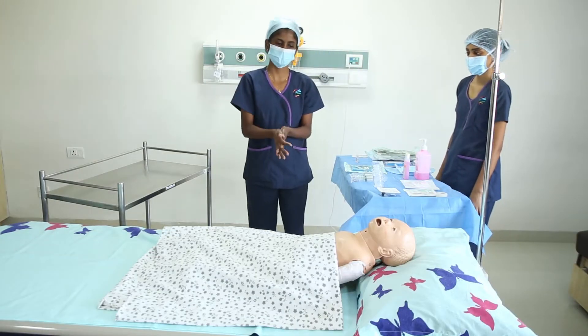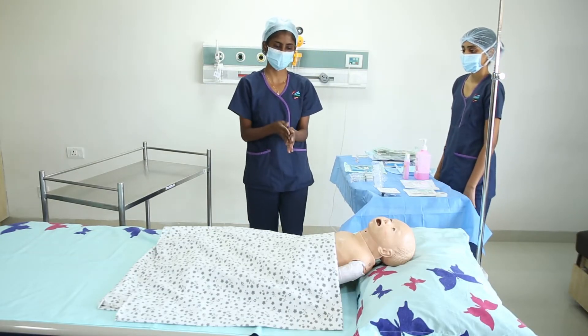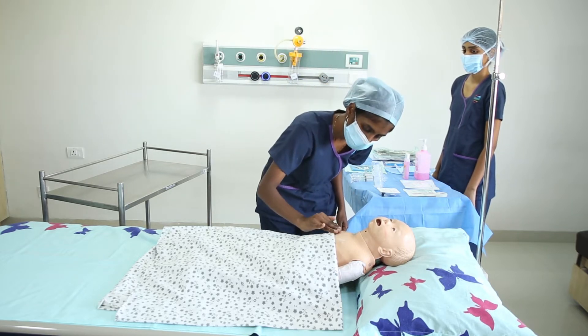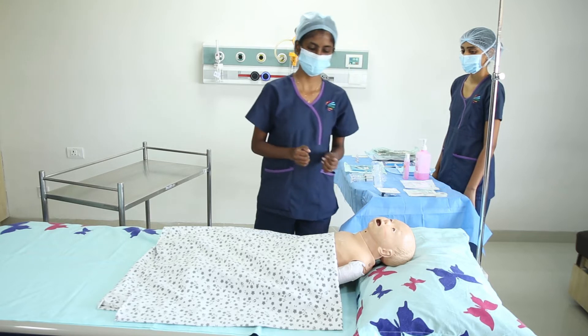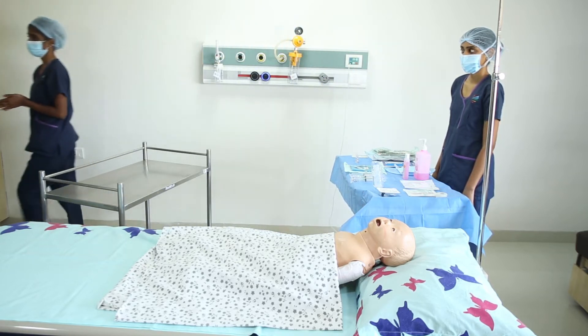Before starting the procedure, first inspect the area of the chemo port to look for any redness, tenderness, or warmth. If any such thing is present, then inform the respective doctor.